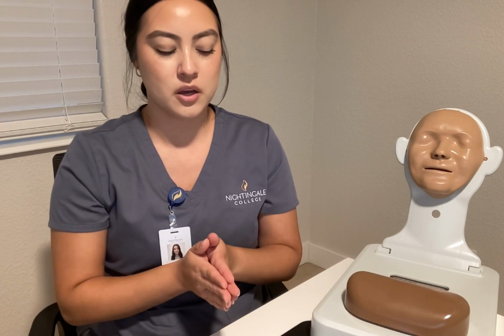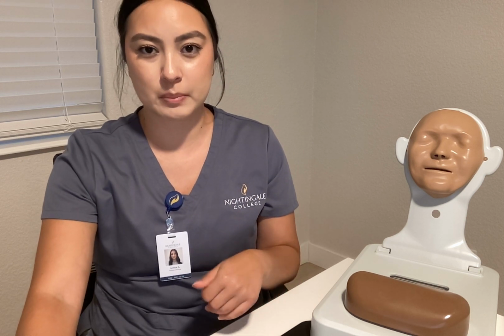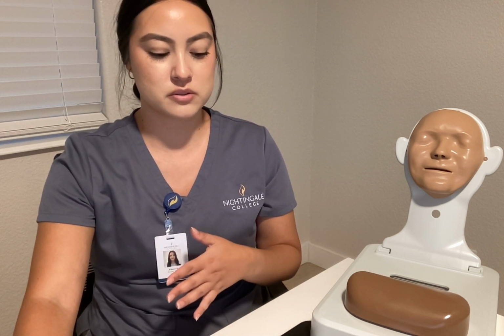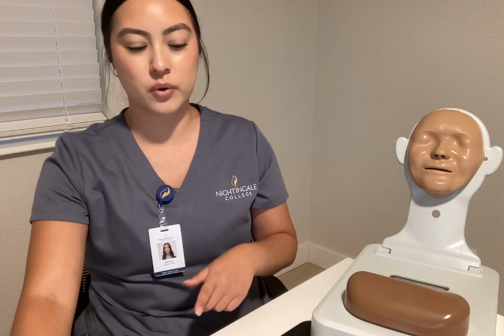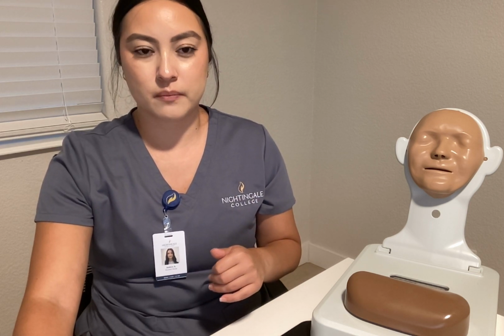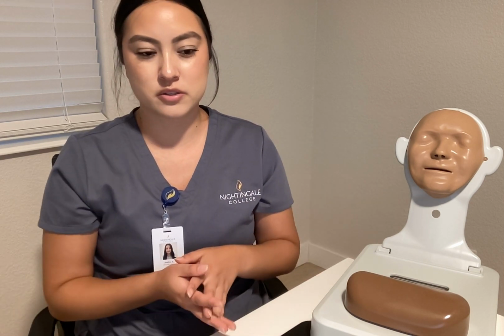Before we get started, we want to make sure that we review the order from the provider and what we're doing today for our patient. So in this case, we are going to go ahead and do a TB skin test, or a Tuberculin skin test. The order calls for 0.1 milliliters intradermal times 1 dose. So after confirming that in our orders against the EMR system, we'll go ahead and again gather our supplies.